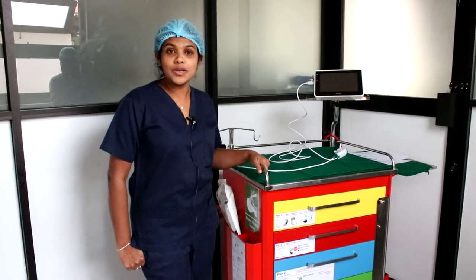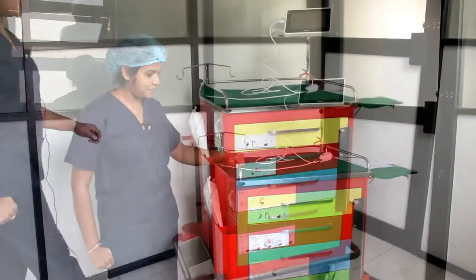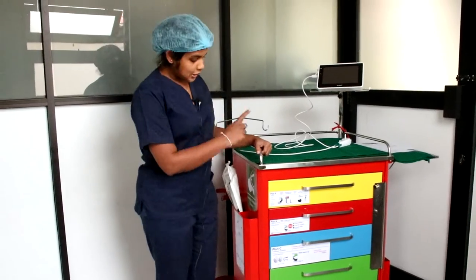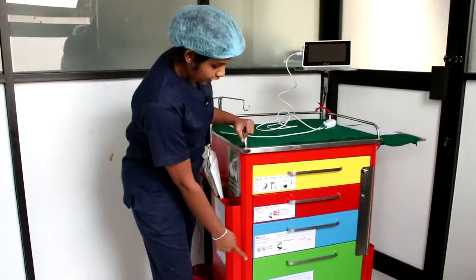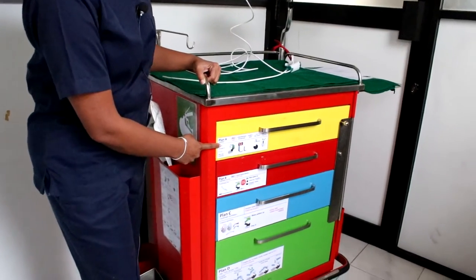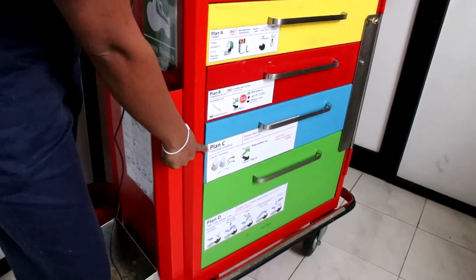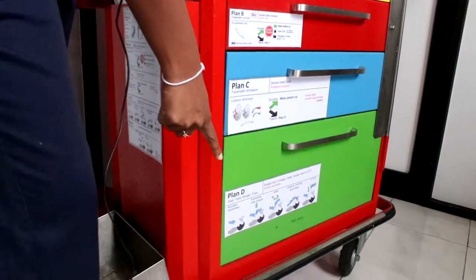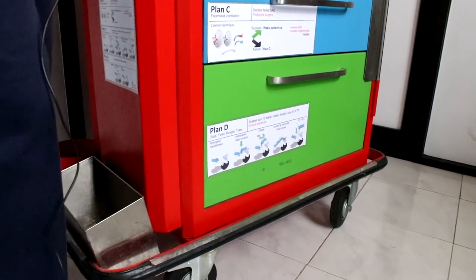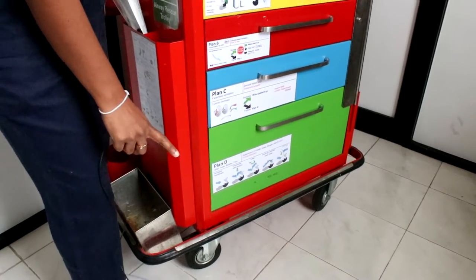Now let's get familiarized with the contents of the difficult airway trolley. As you can see, there are four drawers and they are labeled as Plan A, Plan B, Plan C, and Plan D — that is in accordance with the Difficult Airway Society guidelines.